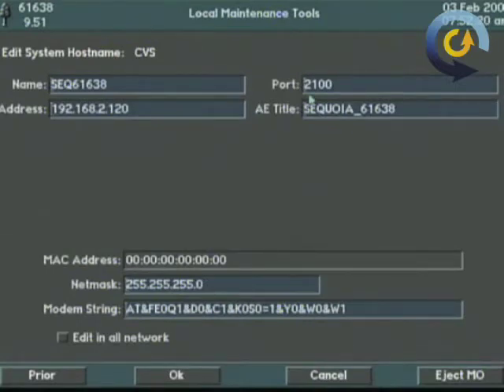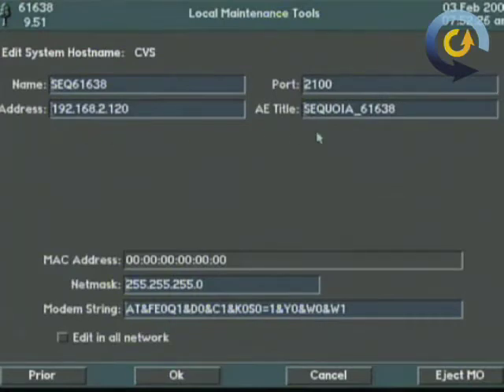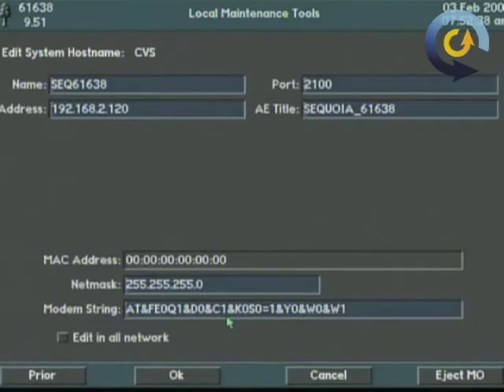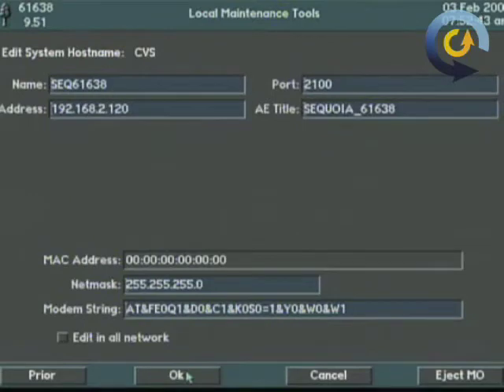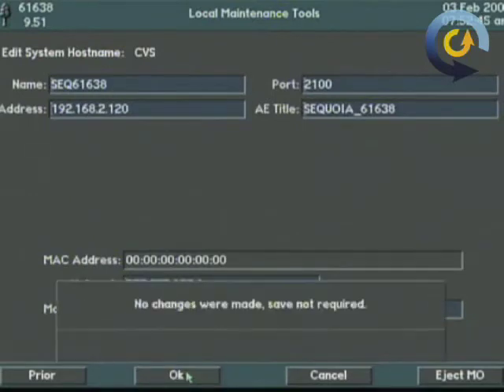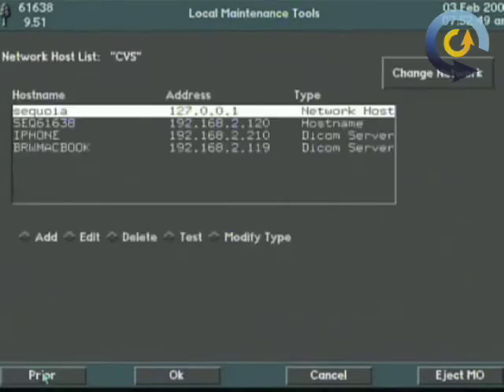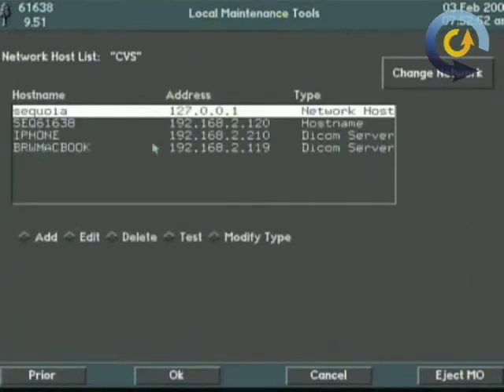But the Sequoia IP address and the AE title will be given to you by the IT department at the hospital or whatever facility you have or yourself if that's the case. NetMask will almost always be 255.255.255.0. Everything else is pretty much irrelevant. I think the string right there is for Acuson to dial in and hit okay. We didn't make any changes so nothing have to be changed but that's as simple as setting up the Sequoia with the IP address and AE title that was given to you.